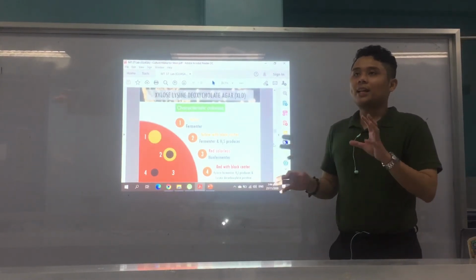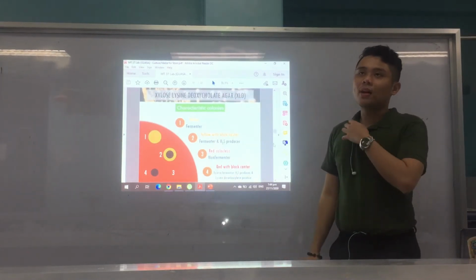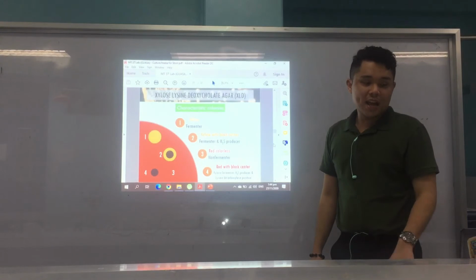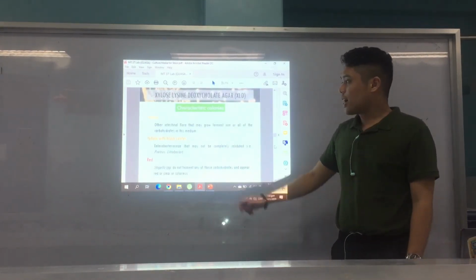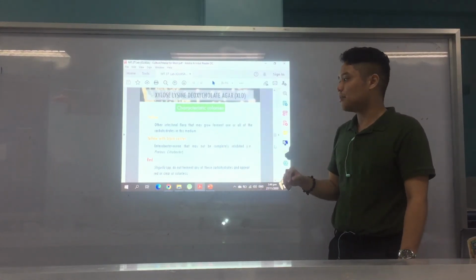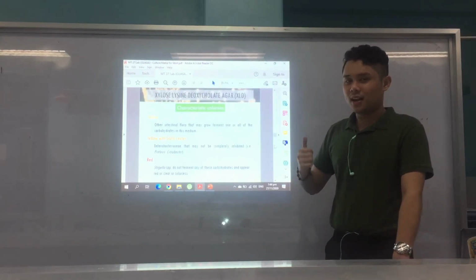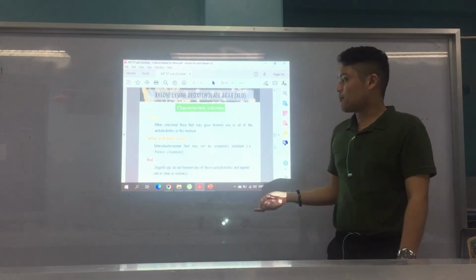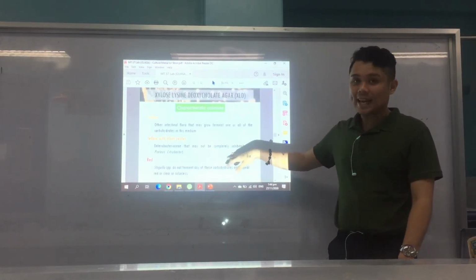So, you're detecting decarboxylation of lysine. Remember na ay lysine. So, therefore, you're determining also if capable ba siya decarboxylation of lysine. And for yellow, again, other intestinal flora that may grow ferment. So, mga E. coli, Klebsiella, etc., mga fermenters. Yellow with black, enterics na produce og H2S na fermenters. Example, Proteus, Citrobacter. They produce H2S, which may not have been completely inhibited.